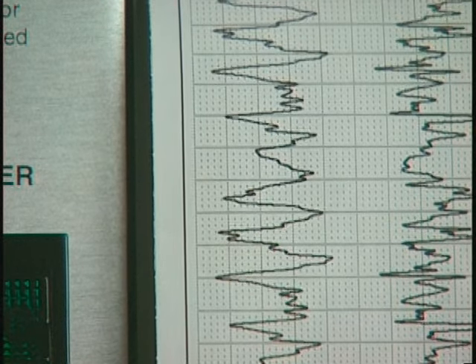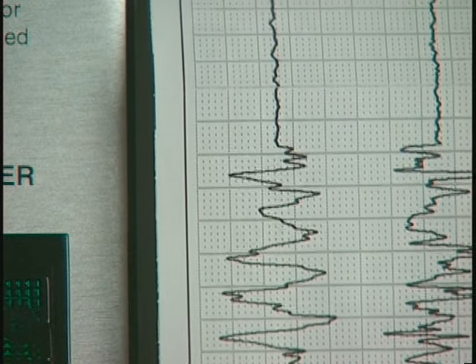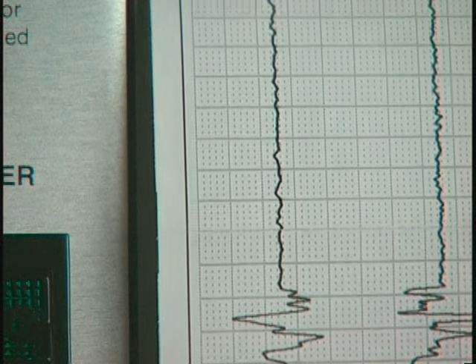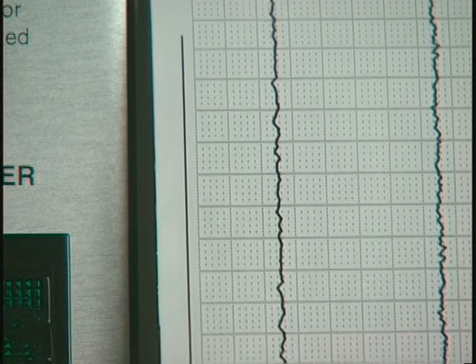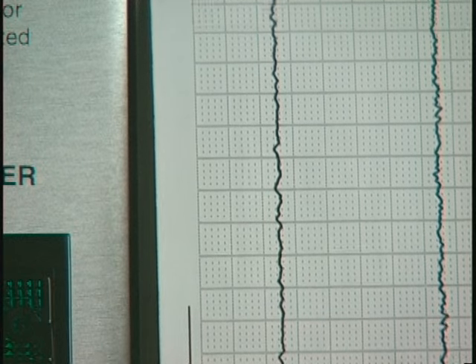A broken or intermittent ictal line reflects waxing and waning or intermittent seizure activity, and complete cessation of the ictal line for 2 or more seconds indicates seizure termination.